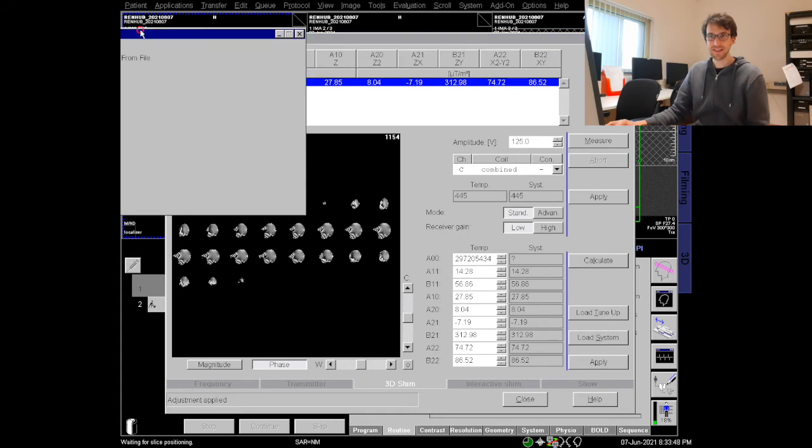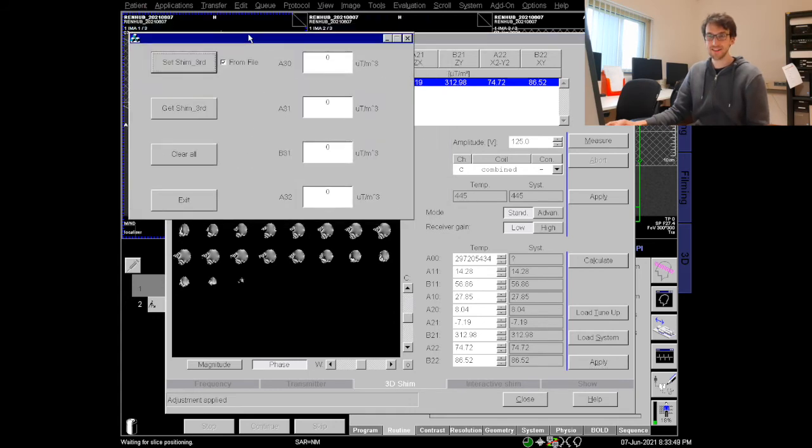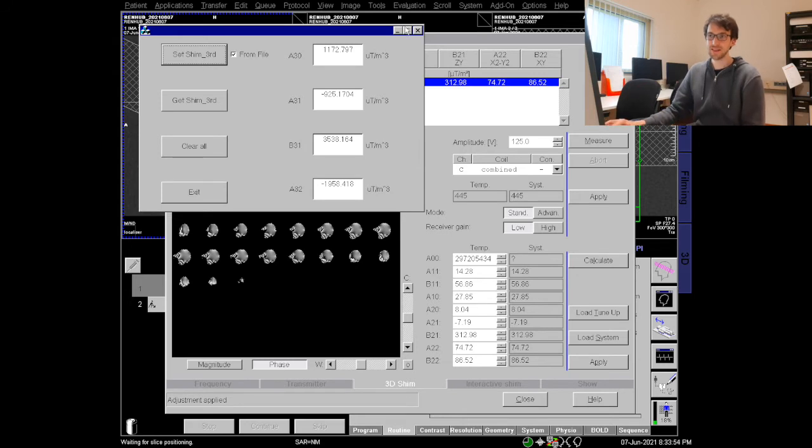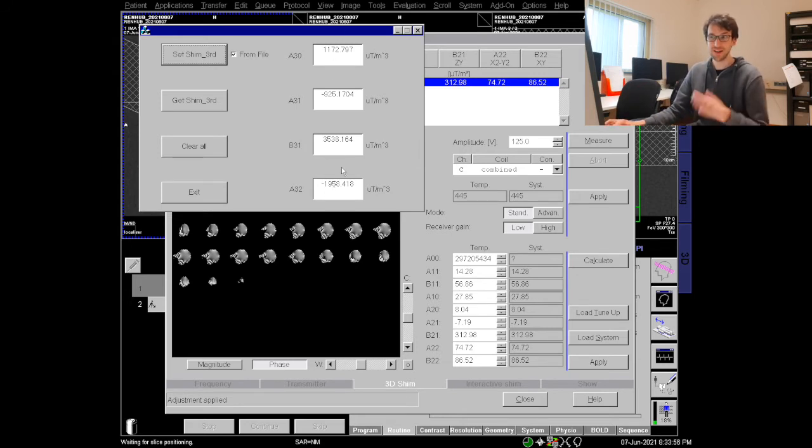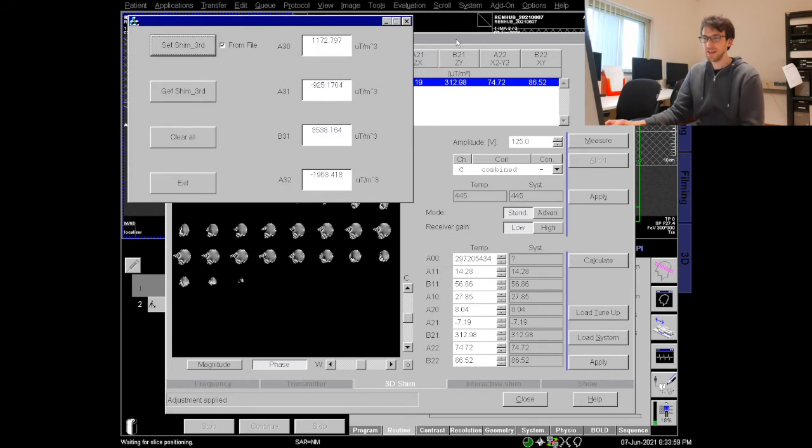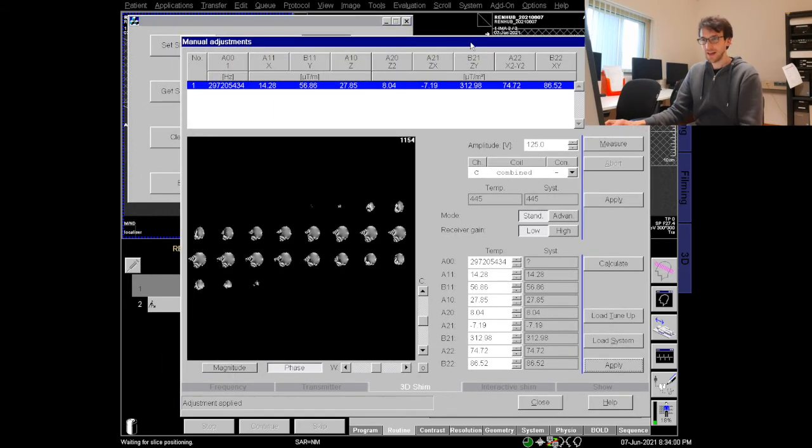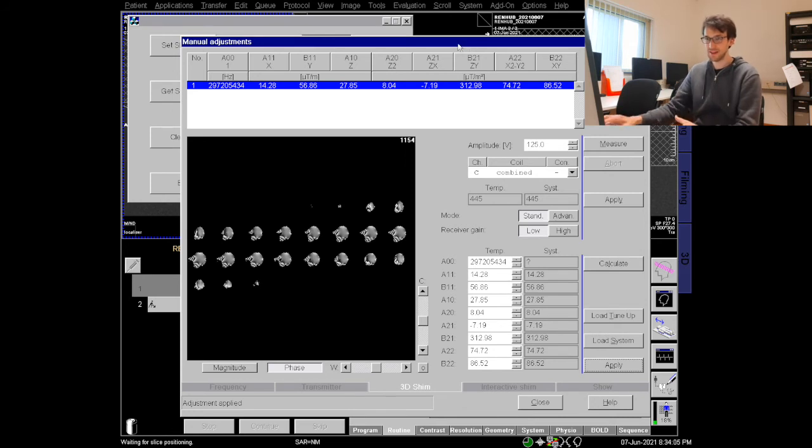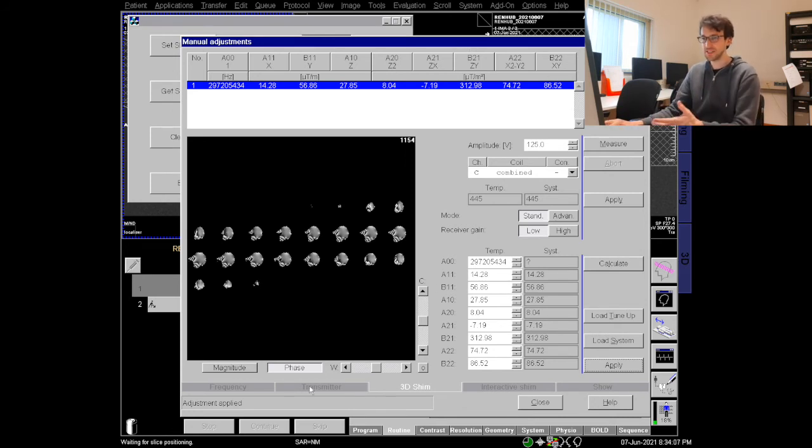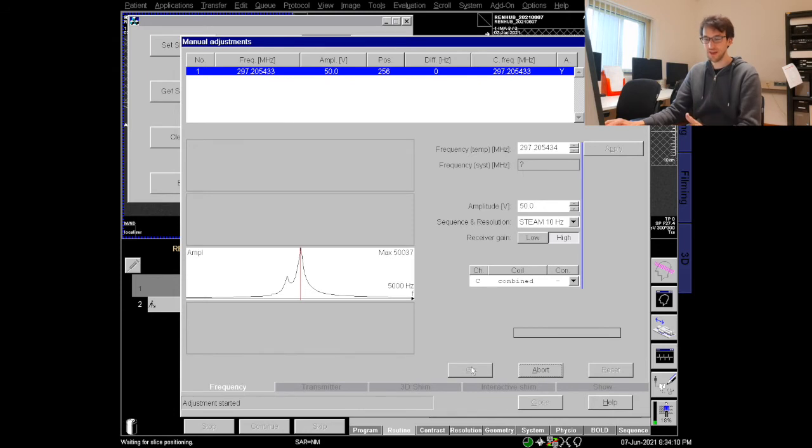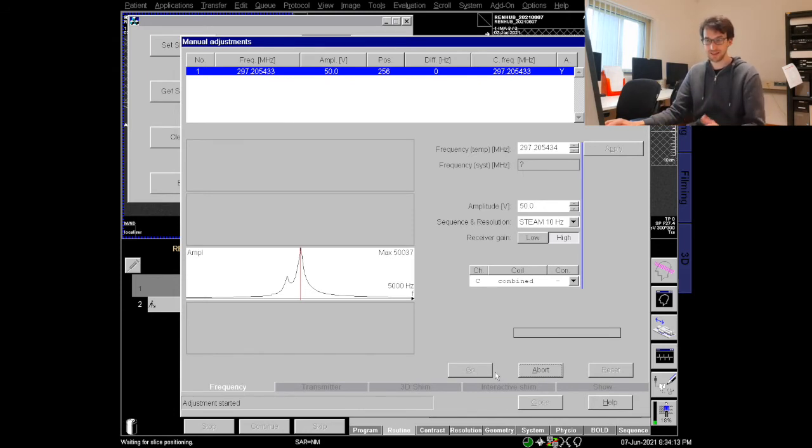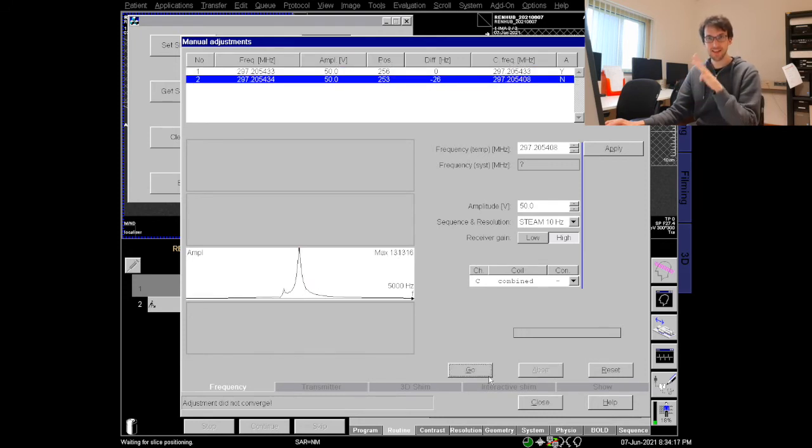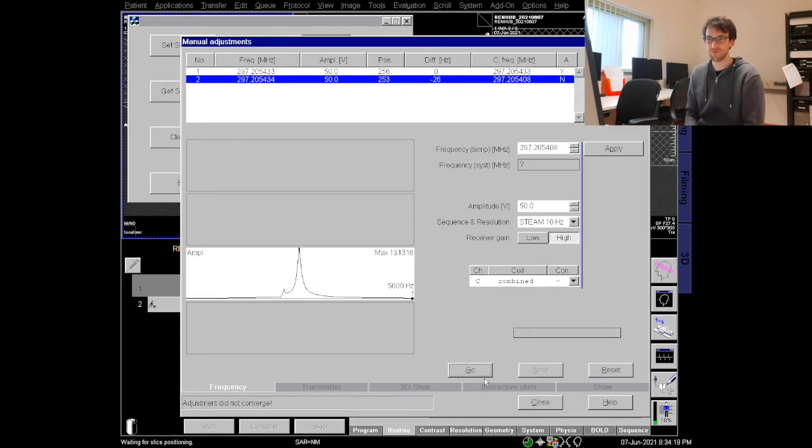I usually do this procedure two or three times iteratively and with this procedure I mean I do the frequency. If I hit go and then do measurement, calculate, apply, set. Always go, measurement, calculate, apply, set. This is the kind of circle of the three buttons you need to click.